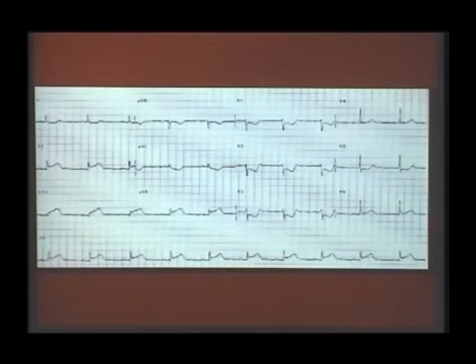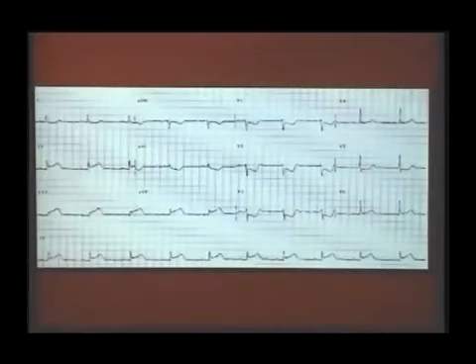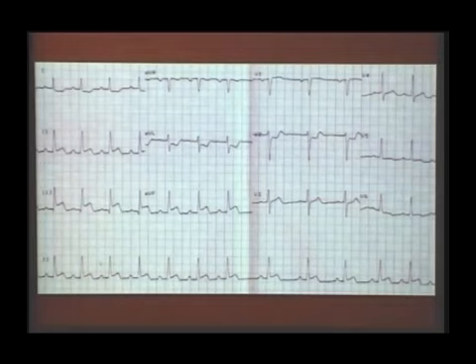So in the hyperacute phase, at this point it is totally injury only. There is no infarction. That's why in all these ECGs you can see that ST is elevated but the QRS is normal. Similarly in this ECG you can see that ST is elevated and the QRS is normal. Still the R wave is very well there. What does it mean? At this point this myocardium is injured but not dead. So if you are able to open up an artery and restore the blood flow to this myocardium, you continue to preserve an R wave, which is the sign of viability.